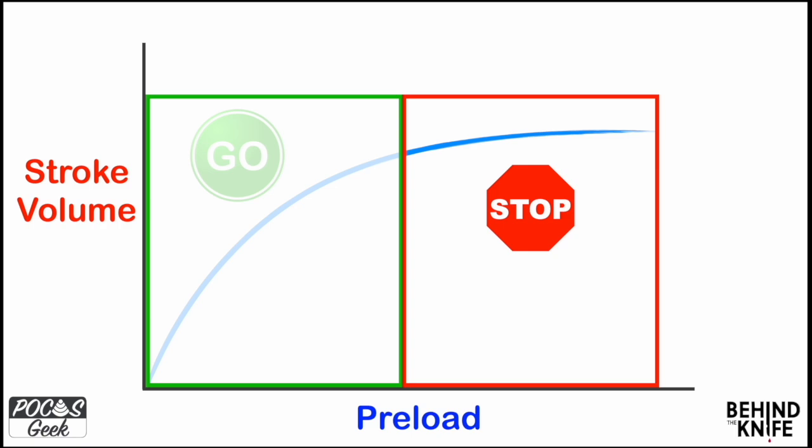And ultrasound's been presented as one way to do this. There is some good utility, and this has been changing and growing and evolving, and it will continue to do so. What I want you to keep in mind is that what I'm going to teach you today needs to be taken in context. These are single data points, and they need to be taken in correlation with everything else. I don't think that any one measurement should guide us; we need to take this in conjunction with everything that's going on with our patient.